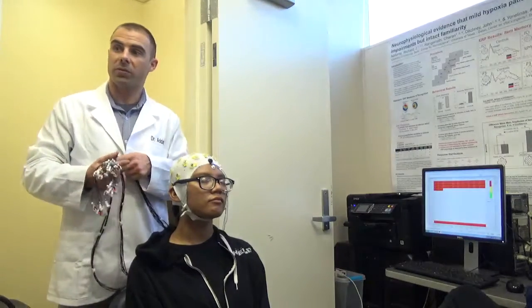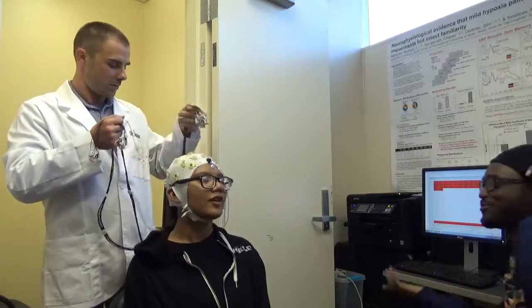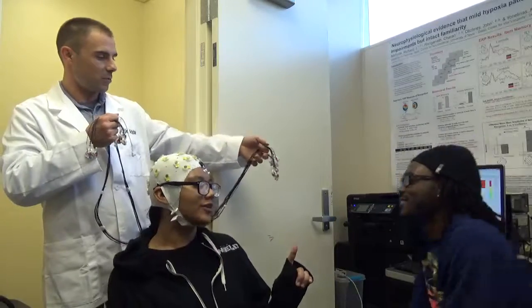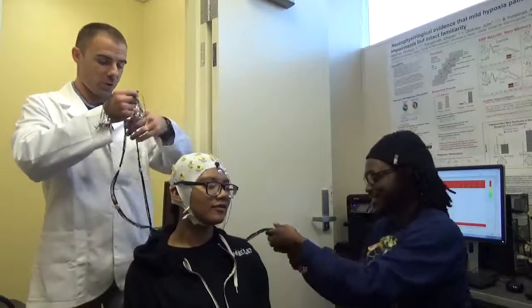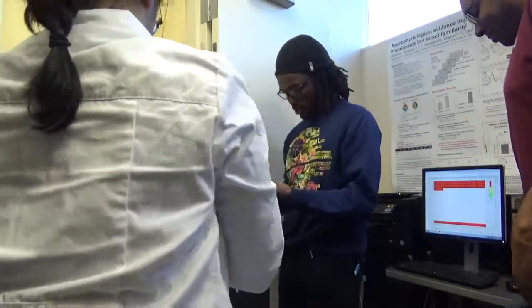Okay, who wants to help out on this side? Go ahead, Alex, you're the closest. Why don't you delegate one of those bundles to somebody? We're gonna need other people here, guys. So you want to get that side? Yeah, I won't bite. Somebody here.